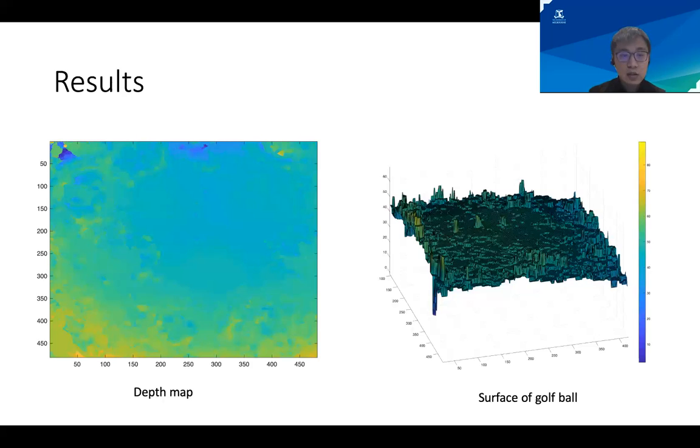This project utilized OCT for creating a three-dimensional image of the cortical surface. Then the micromanipulator inserts implantable arrays into the cortical surface.